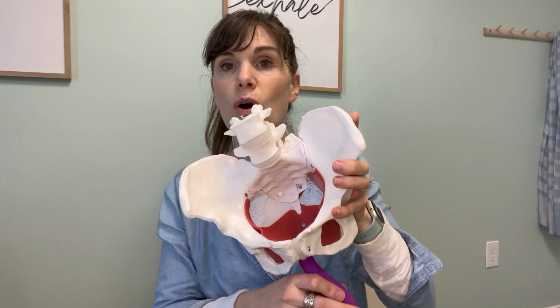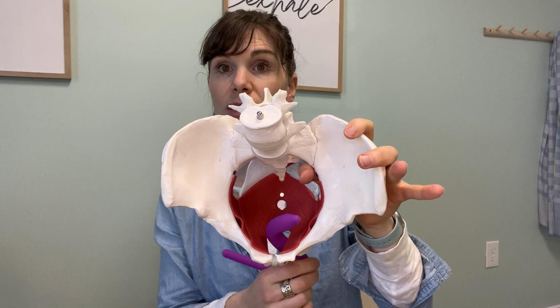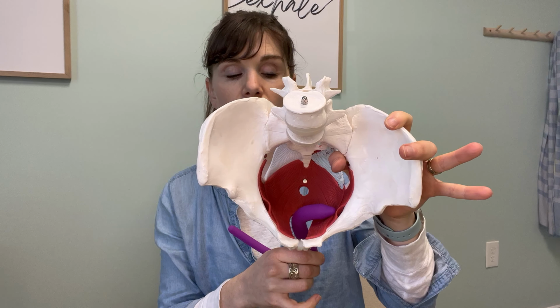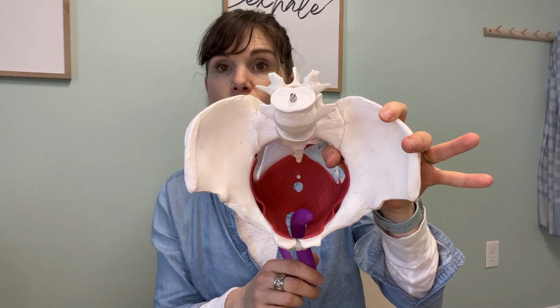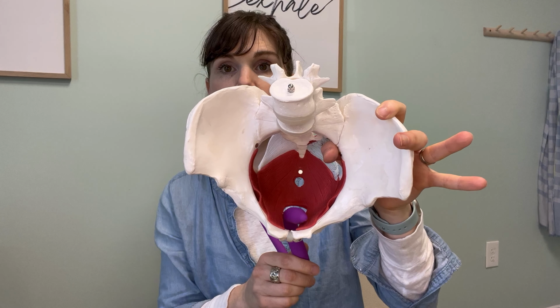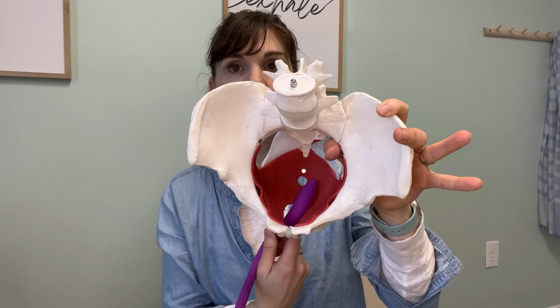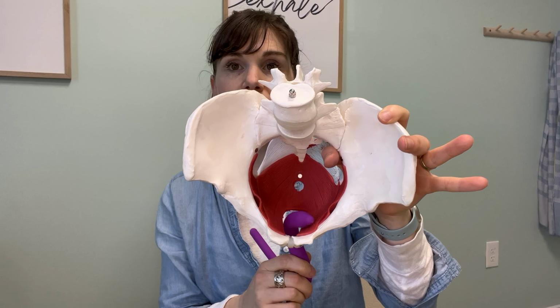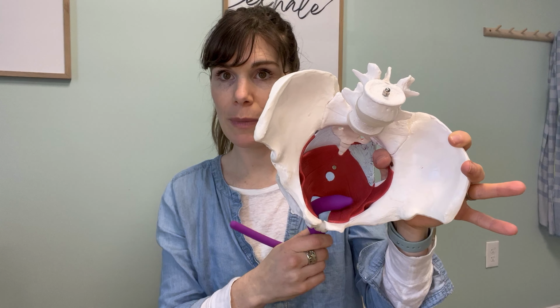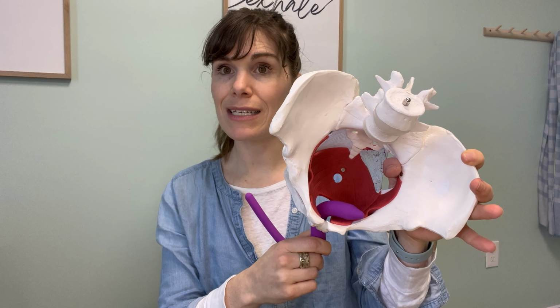So then what you can also do, and you can do this at varying levels, is insert even deeper to get to some of these outer portions of the pelvic floor. Then you can bring it back to the front again, and you notice I'm not going straight to 12, I'm going off to the side, and you can sweep from front to back. And so you're giving yourself a pelvic floor massage. Again, this is not a deep tissue massage.